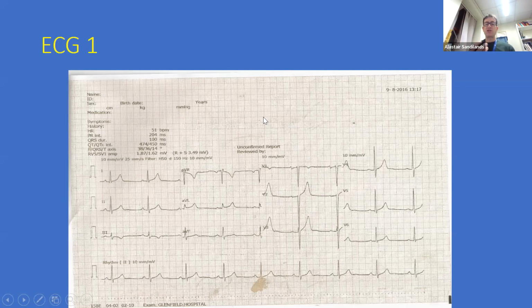I think the more ECGs you see, you get used to what is abnormal and what is normal. Clearly in an exam situation, we will always give you the obvious ECG, not something that's subtle. We don't expect you to look at subtleties. So in any exam, you will have very abnormal ECGs where other people, non-specialists, non-cardiologists, can pick up the abnormality as well.